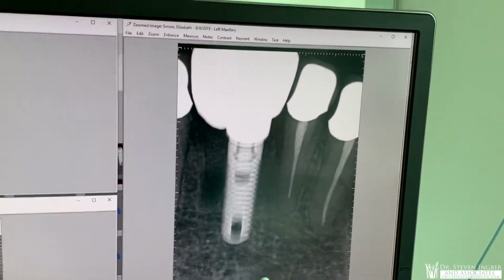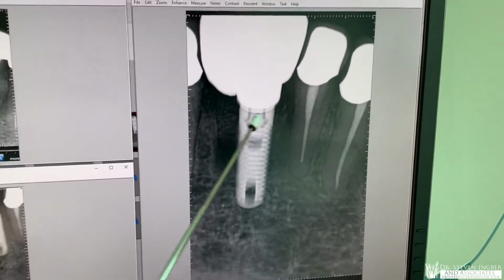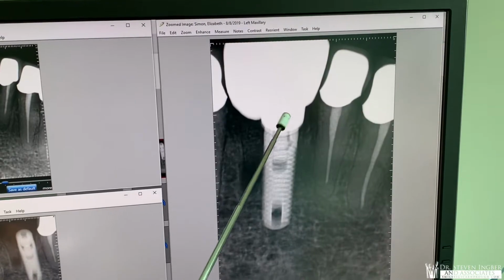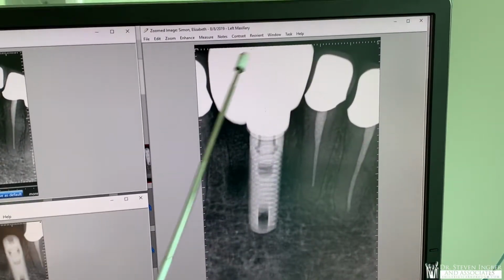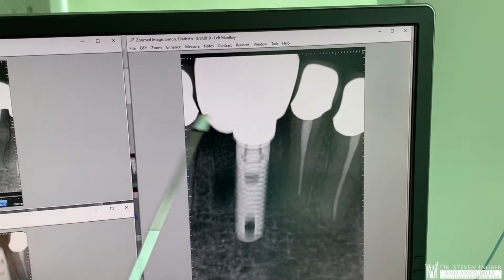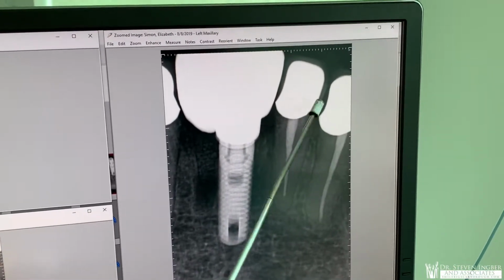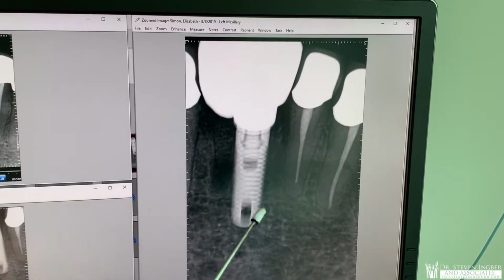So here's the implant in place with the Ti base, which is a certain type of metal that the zirconia porcelain attaches to very strongly. And if you see the width here, it kind of looks odd, doesn't it? But if we go from here to here, it looks a little bit like from here to here for the other 2 teeth. So there's 2 teeth on top of one root.